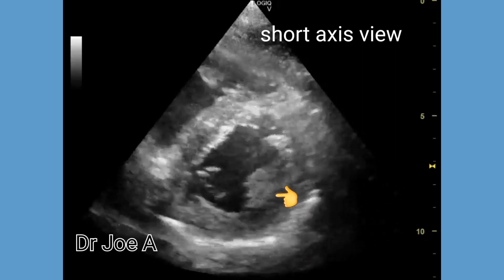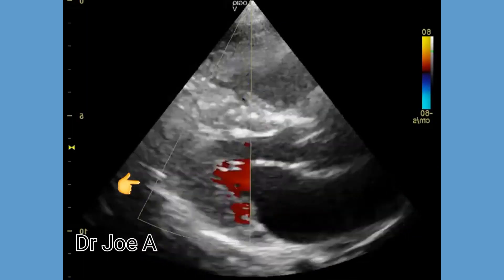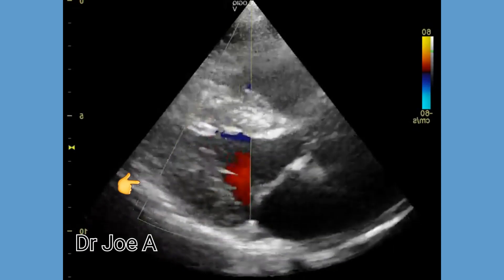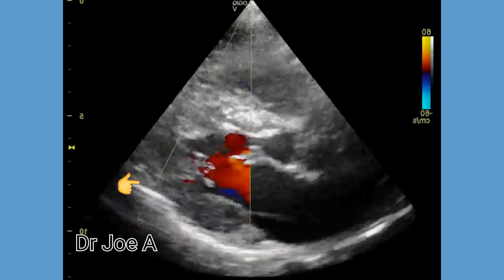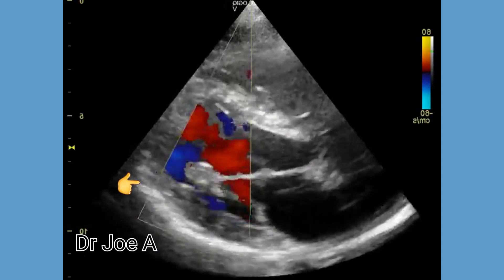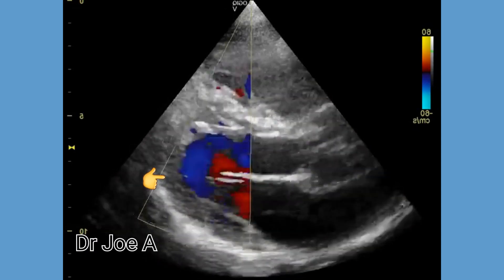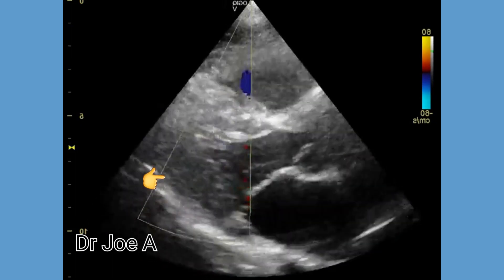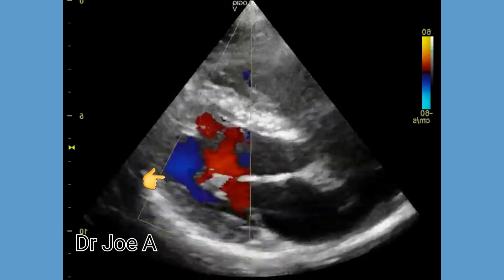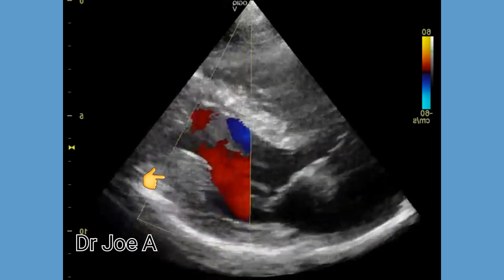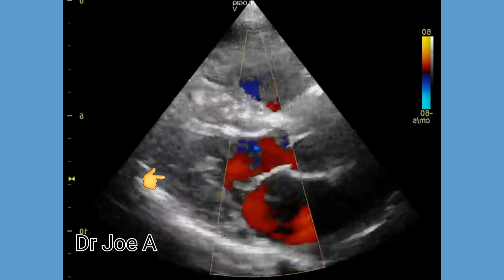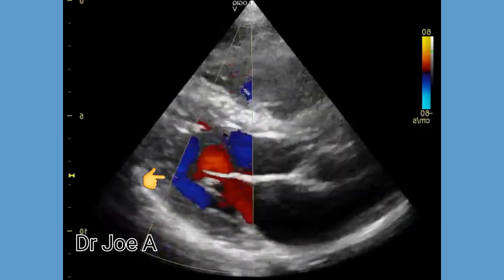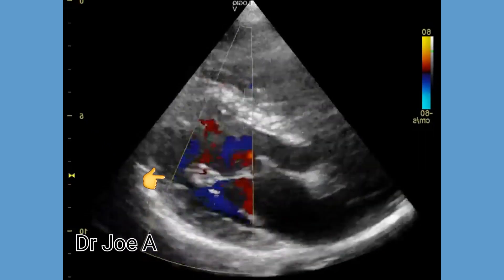In rare cases, papillary muscle hypertrophy may be associated with sudden cardiac death. Color Doppler of the mitral valve shows normal flow across the mitral valve, with flow around the hypertrophied papillary muscle. The final diagnosis is hypertrophied posteromedial papillary muscle, and further investigation may be needed to confirm the diagnosis.